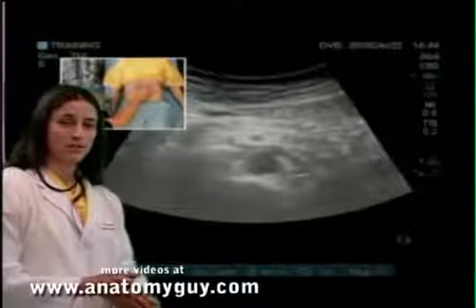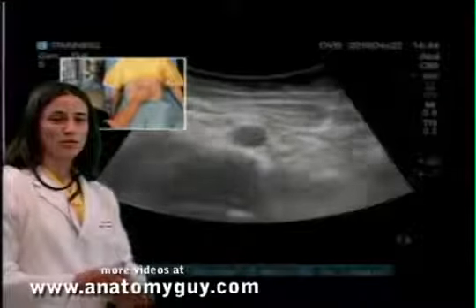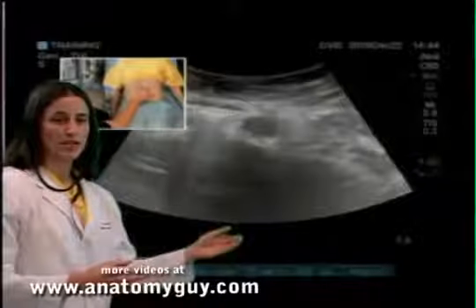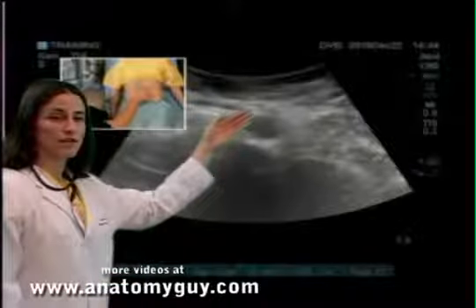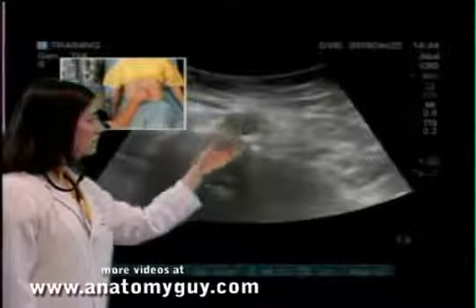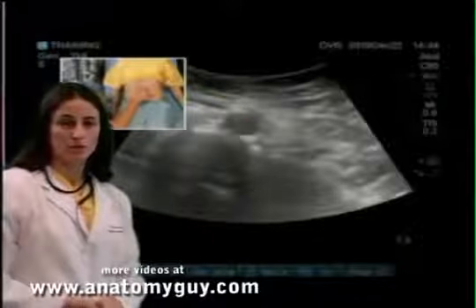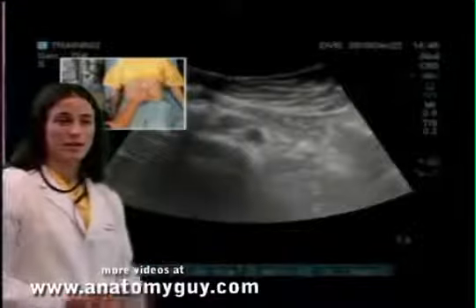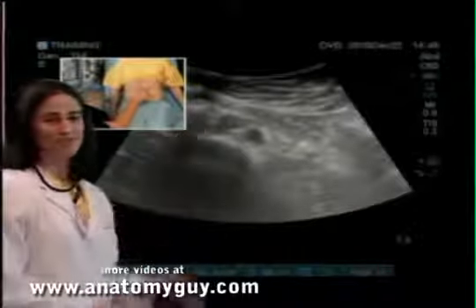Now continuing on our scan, we're scanning down towards the feet. We watch the aorta, it looks nice and round. There are no saccular outpouchings. We freeze right here. Right before we branch off to the common iliac arteries, we're going to measure again from this outer wall to this outer wall, and we want this measurement to be 3 centimeters or less. Continuing our scan, we watch the common iliacs break off into the patient's left and the patient's right.